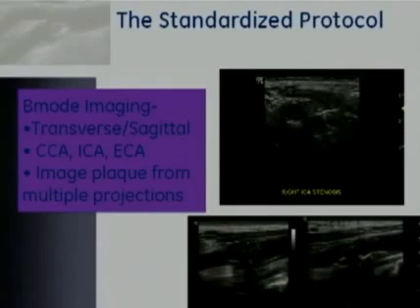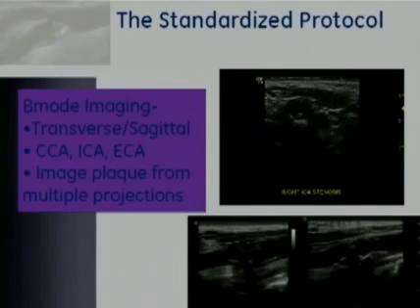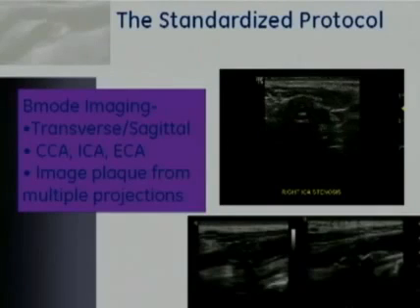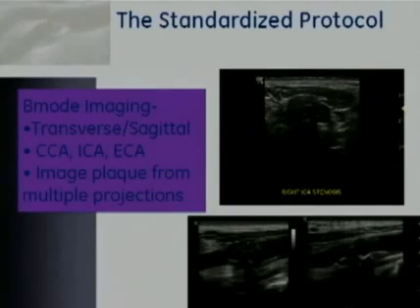What I'm going to start with is the standardized protocol. It's very important that within each lab performing carotid Doppler you have a protocol that is written down and can be followed by everyone in the laboratory. This will standardize the procedure and is very important for follow-up of patients.